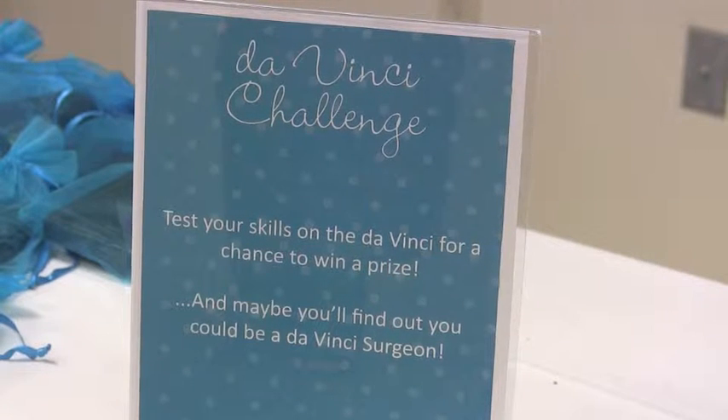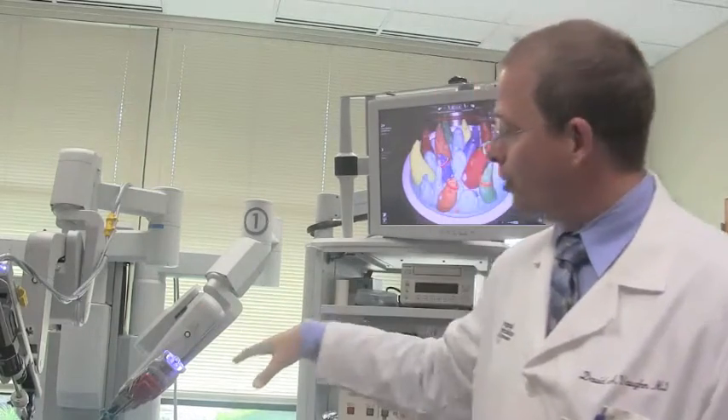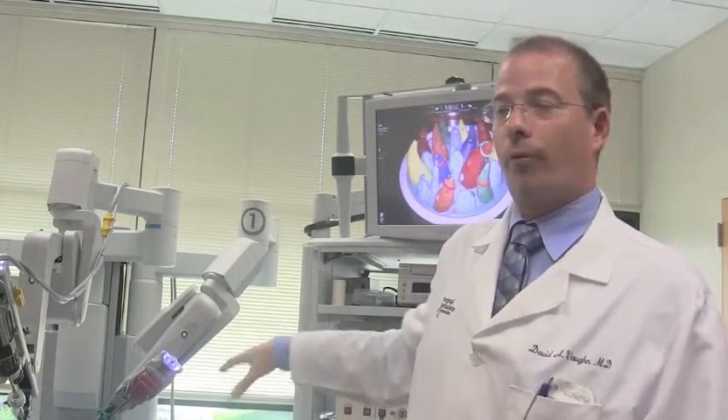We're showing patients how this works and letting them actually test drive the robot and pretend that they're operating. This is actually what we do and the first tools that we use to practice when surgeons are going through the training.